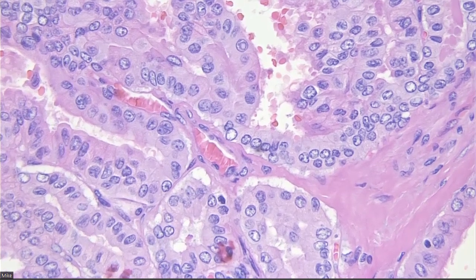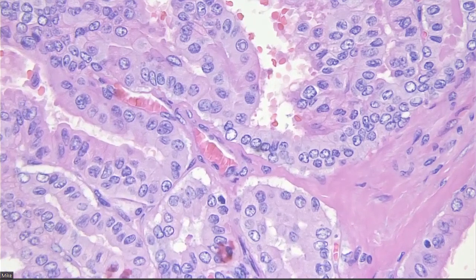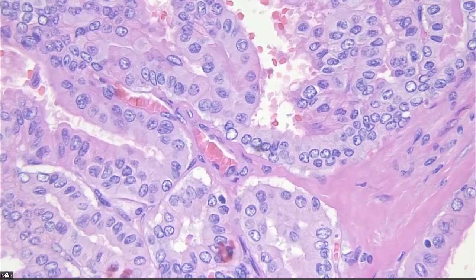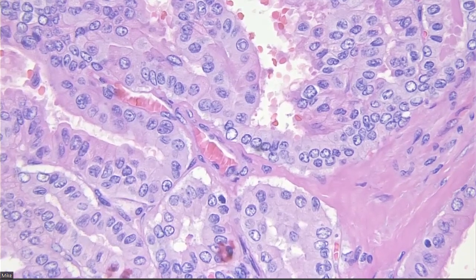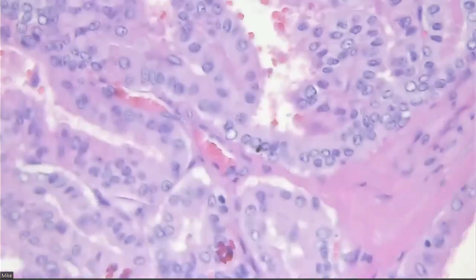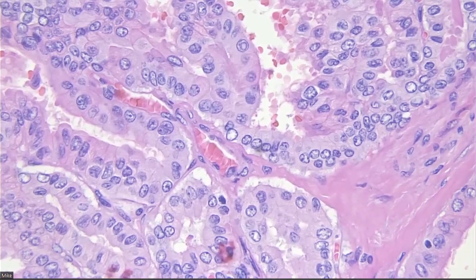Then another nuclear membrane, which is nice and crisp, and then pink cytoplasm again in the middle. If it doesn't fulfill all those criteria, it's not a true pseudo-inclusion, because a lot of cells have artifactual vacuoles and crap that is not biologic, right? But this is biologic. This is a true intussusception of the cytoplasm into the nucleus, and if it meets all those criteria, then it's a true pseudo-inclusion, and I would really worry about PTC. Okay.